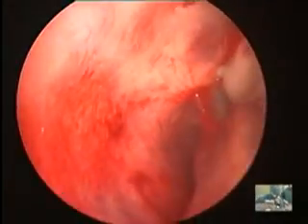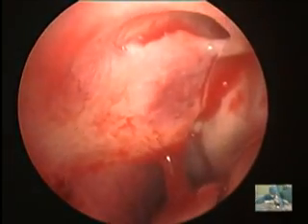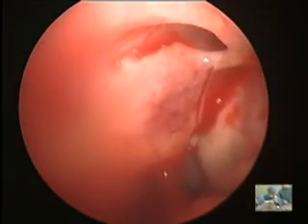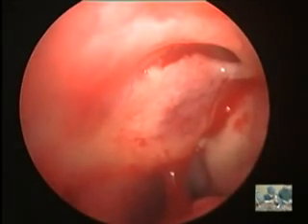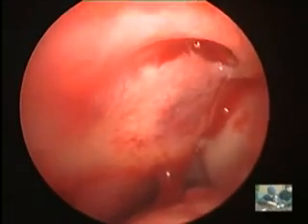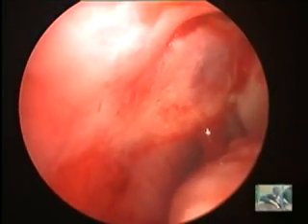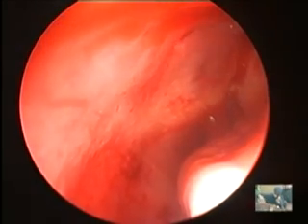Trocar and cannula. Now I have entered the inferior meatus. You can see the nasolacrimal duct opening here. Do you see the nasolacrimal duct opening? Not sure. Can you massage? Yeah, I can see the bubble now. Yeah, okay. Can you get the lacrimal sac gentle massage? You see? Yes. You see the bubble? Yeah, the bubble coming. Okay, so I will try to avoid that. We will place the trocar and cannula over there.